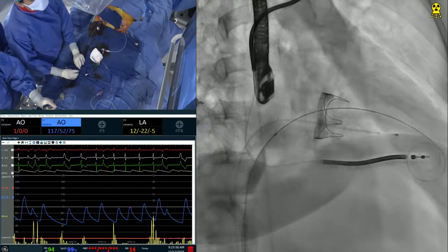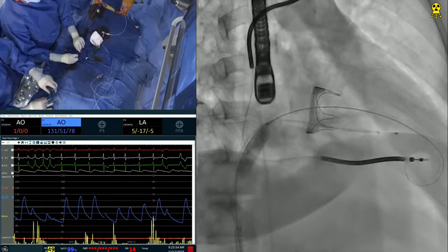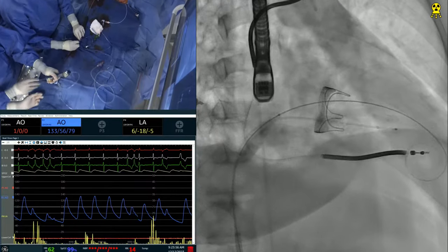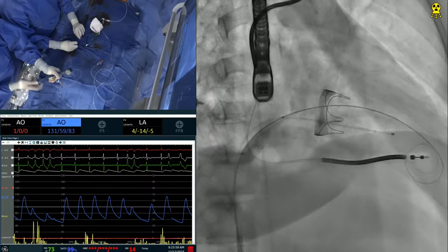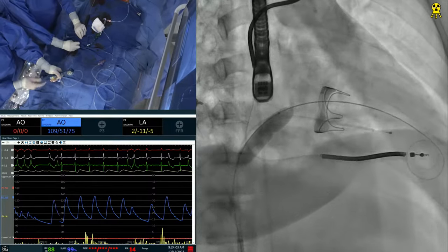Sorry, do you see us? Across the septum? I think we pulled back. Yeah, let me go back. Do one more time. Yes. We are going up now again. You are across. You are across the septum. That's very important. You saw the dent?